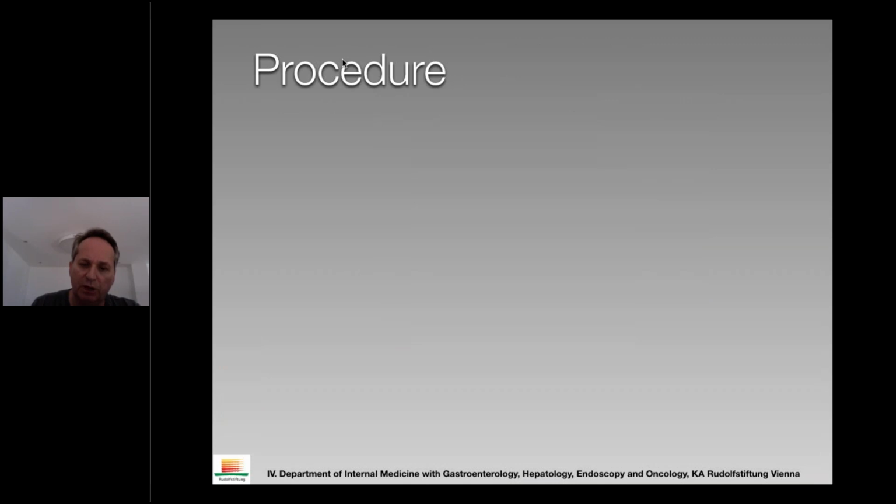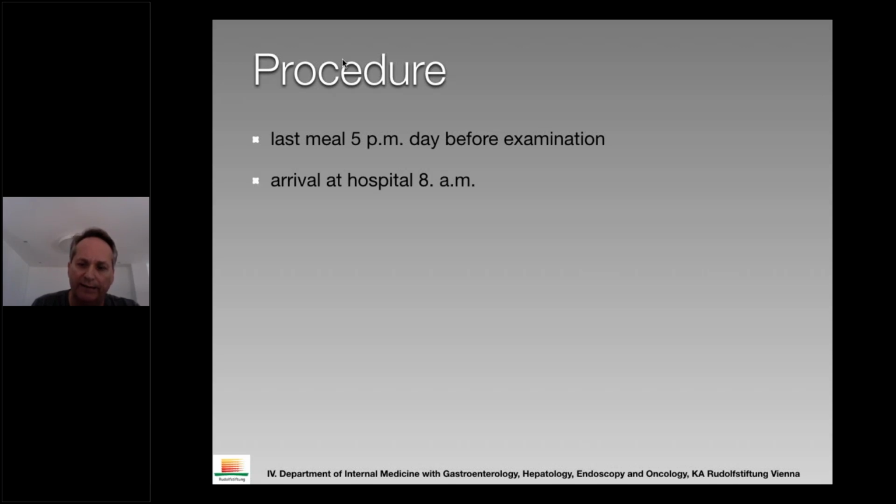So to the procedure, I will tell you how we do the procedure in my unit. We tell the patient that they are allowed to eat the last meal at 5 p.m. the day before the examination. They come to us at the hospital at 8 a.m.